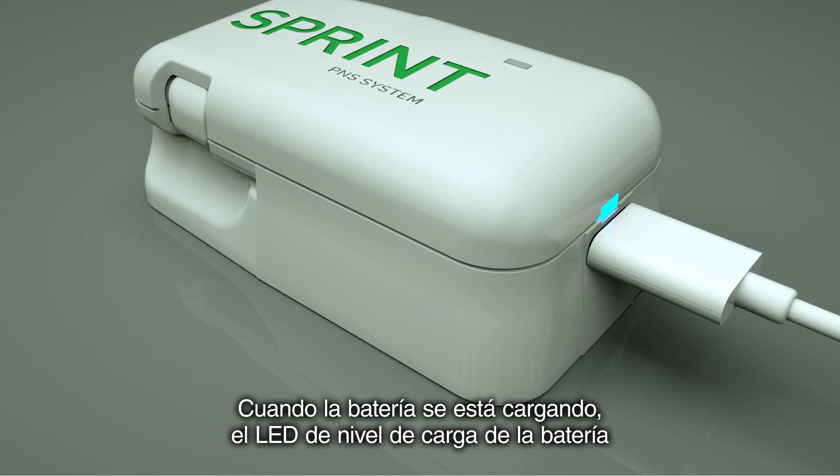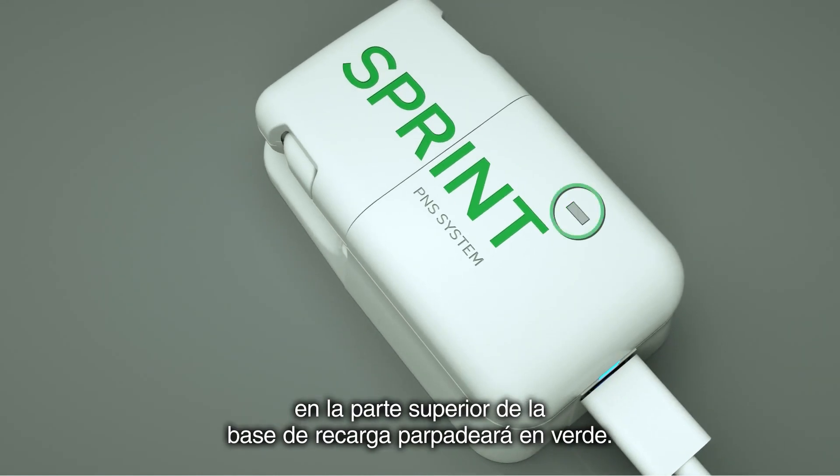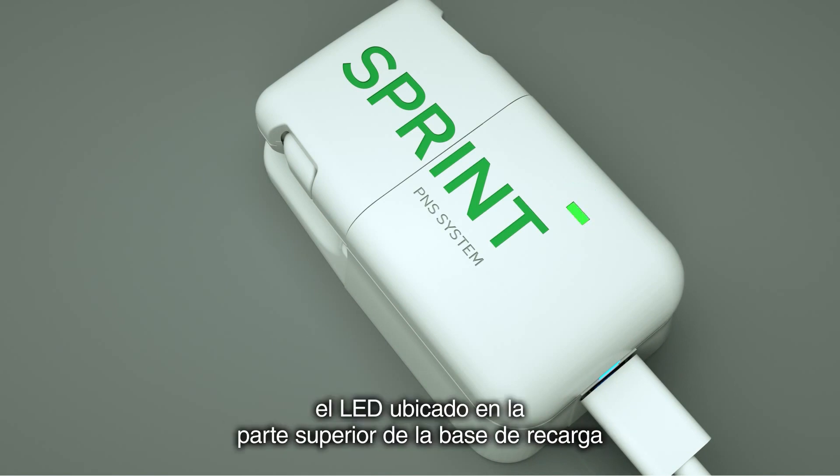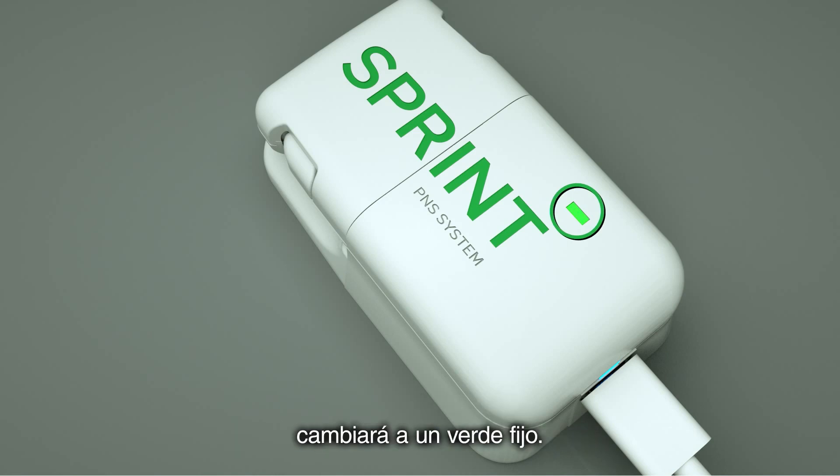When the battery is charging, the battery charge level LED located on the top of the recharging base will flash green. When the battery is fully charged, the LED located on the top of the recharging base will turn to a solid green.